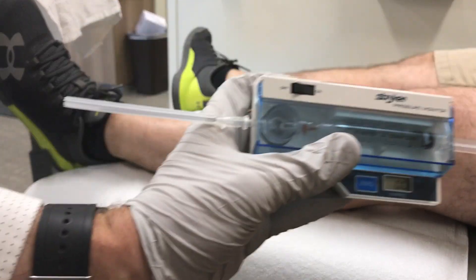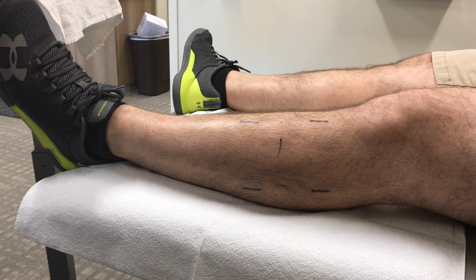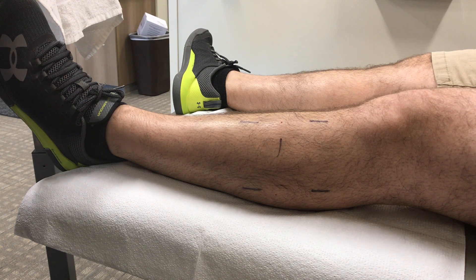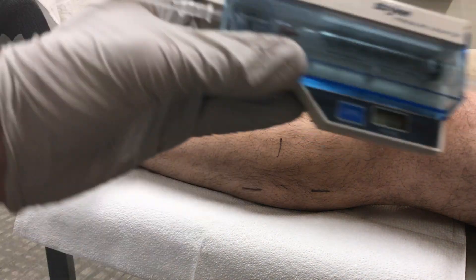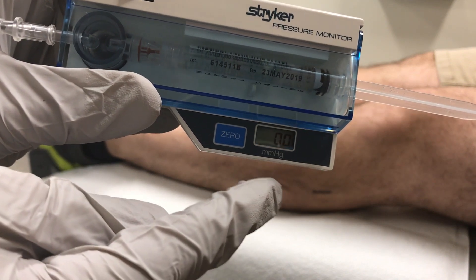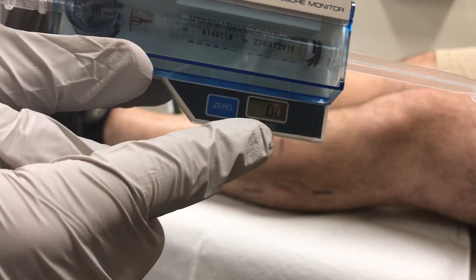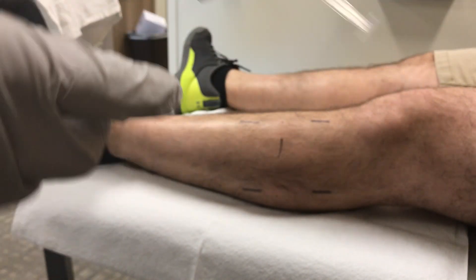I'm using the Stryker pressure monitoring system — it's probably the most common commercialized compartment testing system available. There is a zeroing mechanism for reading the pressures, and once I get it lined up I zero it to make sure the screen reads zero before placing the needle into the skin to test the compartment.